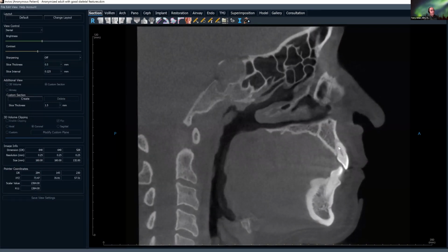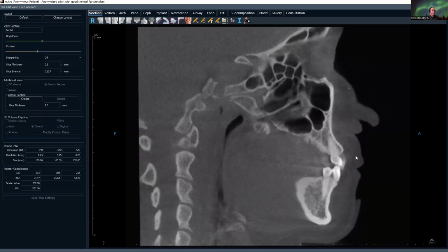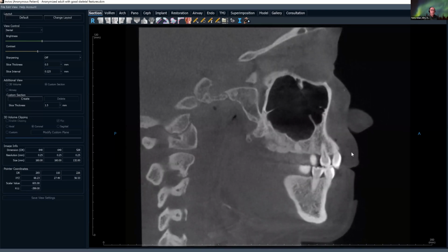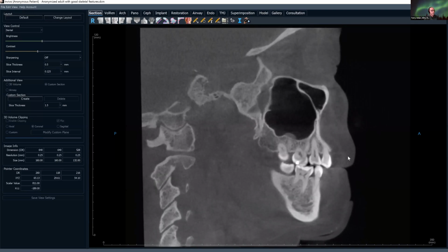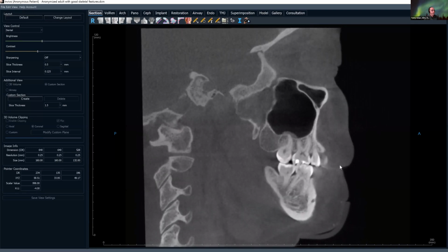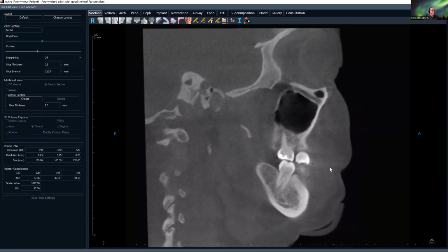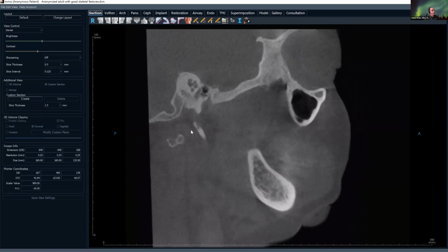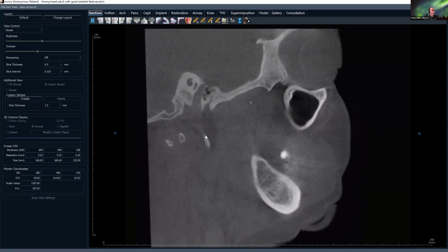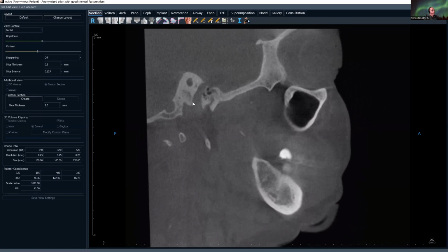going through all of the teeth. You commonly can see the invasive cervical resorption in this view, scrolling through it. You can see other pathosis. You can really see periapical pathosis. That's the beauty of this CBCT, is that it really stands out well. You look at the height of the horizontal bone, and here's the stylohyoid, ossification of the stylohyoid ligament right here. This is not part of what I want to show. This is where the carotid canal comes in.